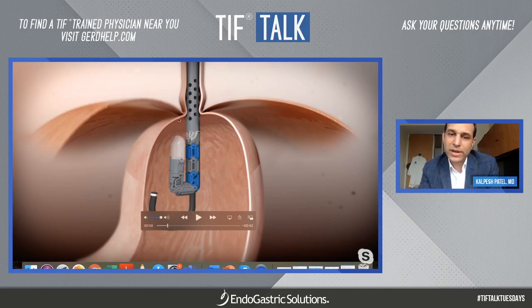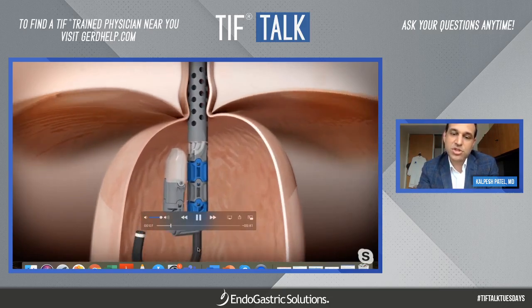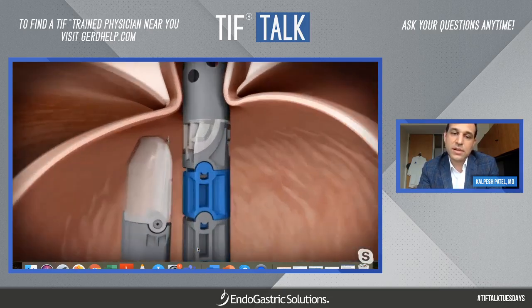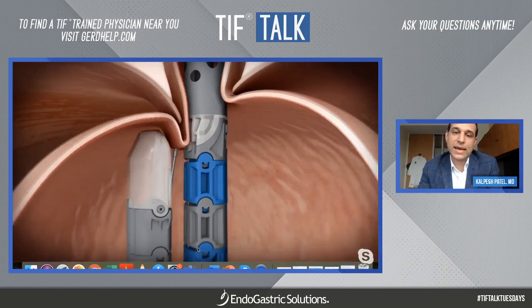So what we're going to do with the procedure is recreate the hourglass or funnel shape by using this device to pull the esophagus tissue, the normal tissue, back down and create a little funnel. I'll show you how that looks here. The device is just going to gently advance up to the esophagus, and using a little grasper, we're going to take your normal anatomy and bring it down.